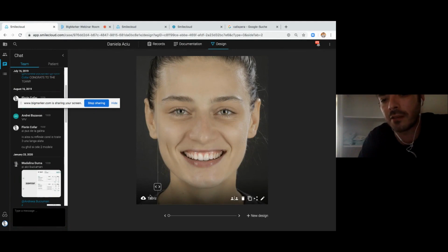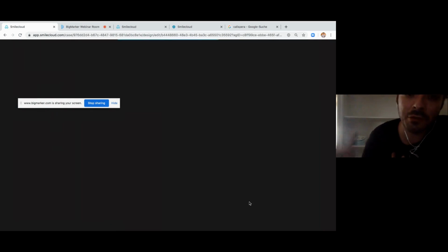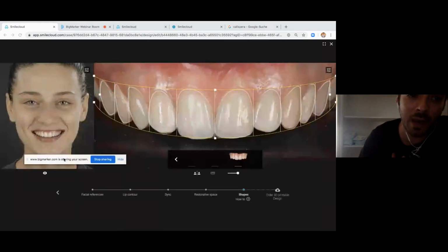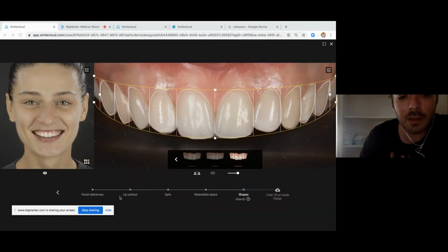You can preview it and you can download the specific library. And if I want to create a new version of this design, I can just duplicate it like I do now. And now I want to show it as a search tool. Like I said, here you basically have a couple of steps. You can see it's like 5 steps to do a design, which makes it quite fast as a tool.